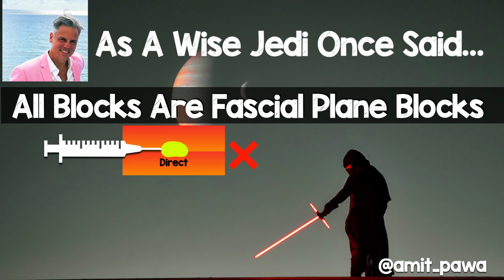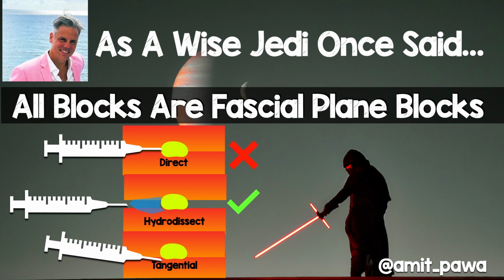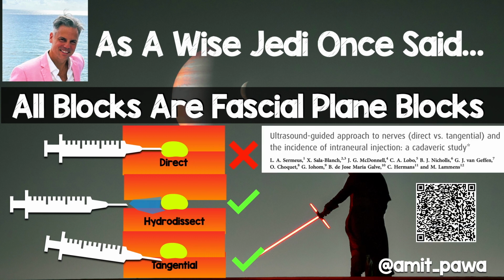Well, actually, we don't need to approach a nerve directly and inject right over there. What we can do is hydrodissect within the fascia getting towards the nerve. That's a safe way of performing the block, and you can do that with ultrasound alone. But also, you can tangentially approach the nerve. So these are all things that we can do when using ultrasound performing our blocks to minimize the risk of harm. And there's a lot of discussion about some of these concepts in this paper over here.